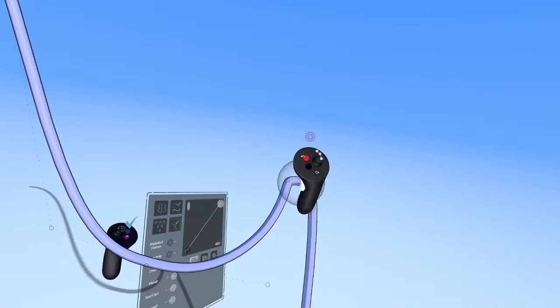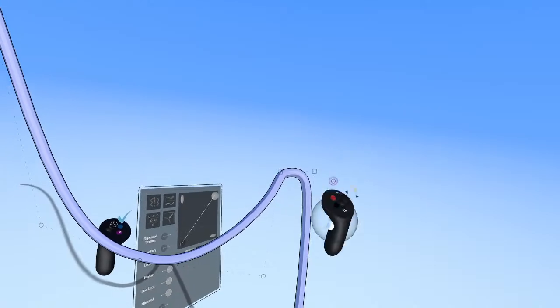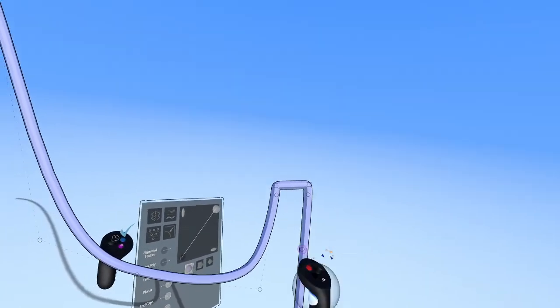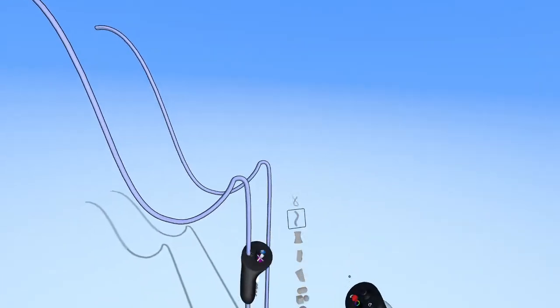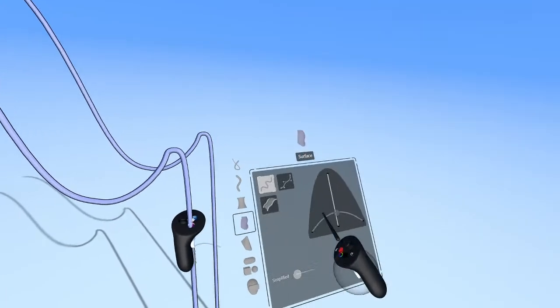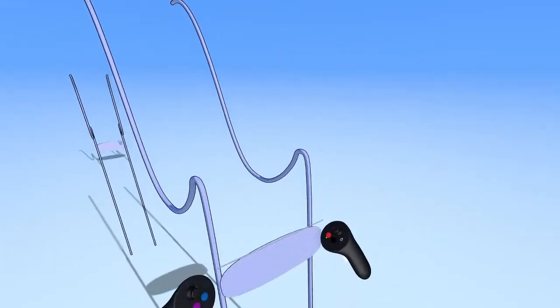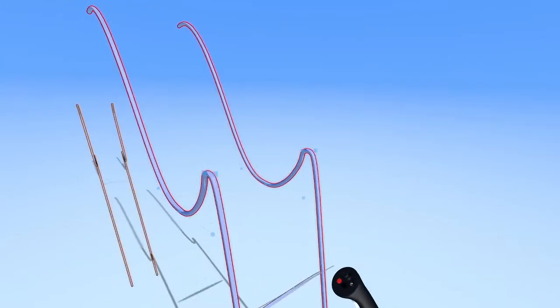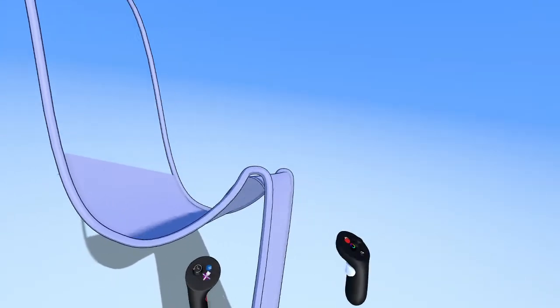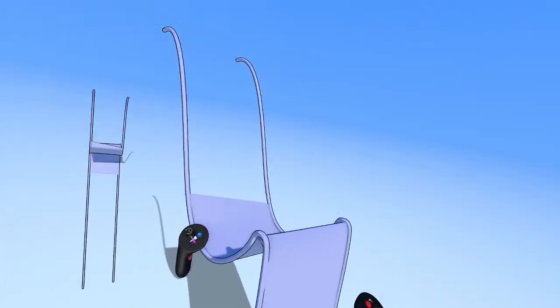So this is a really useful feature, but you want to keep one thing in mind if you're going to do surfacing with the stroke line that you made. And that is, if you're planning to use these curves to make a surface between, and you have weighted NURBS, when you make that surface with bridge curves, it will struggle sometimes with the weighted NURBS, and it will struggle less if you have more edit points. So just keep that in mind.